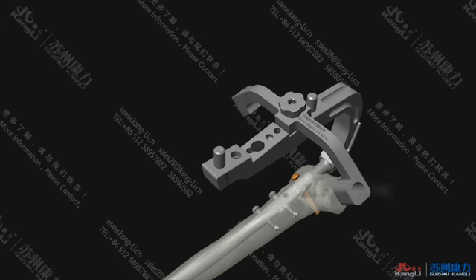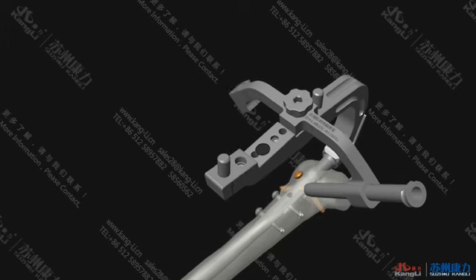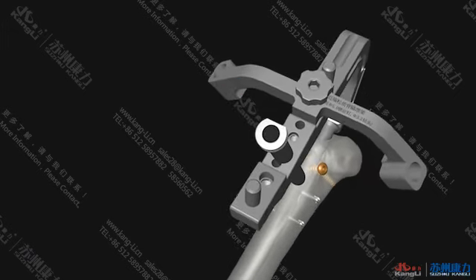Repeat the above steps to finish the placements of the second and the third phi 5.0 locking screw for the oblique as well as the front and rear positions respectively.